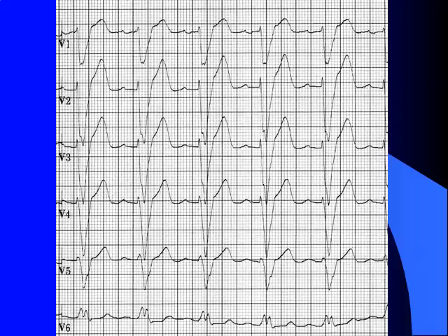The rule of appropriate discordance is held intact here. We have all of our QRS complexes that are negatively deflected, and we have ST segment and T wave that is above the isoelectric line. The ST segment is shifted to the opposite direction of the terminal QRS deflection, and it increases or decreases relative to the degree of elevation.